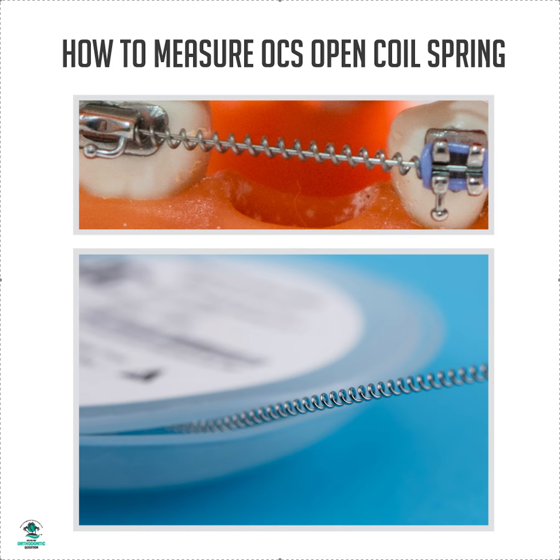How much do you measure it? To play it safe, I like to measure it so it fits exactly between one side of the bracket and the other, and then add a few millimeters at a time. If you only add a few millimeters at a time versus crazy-compressing it, then you need to get your patient back in two to three weeks no matter what.